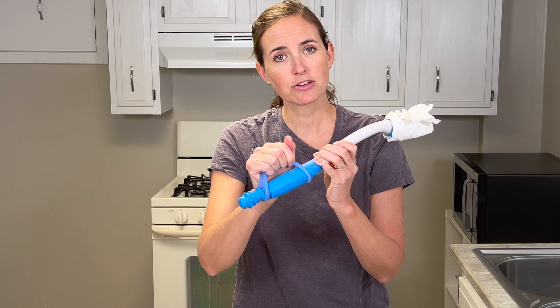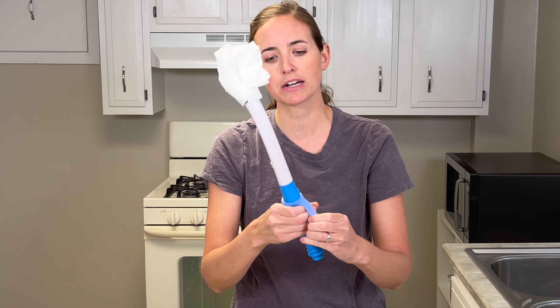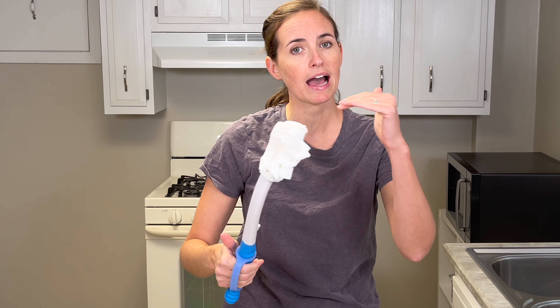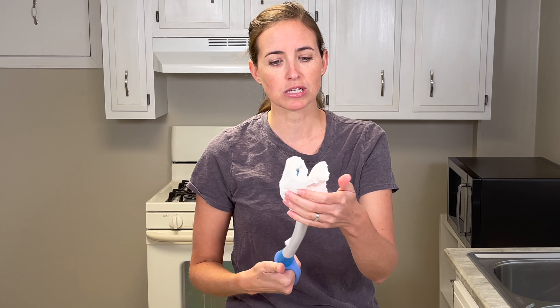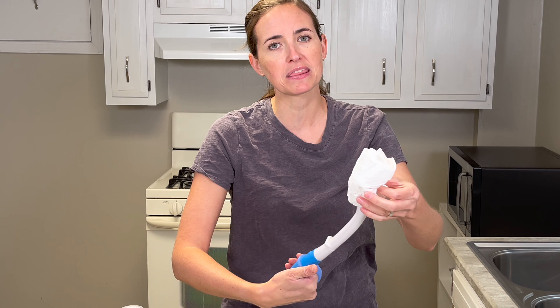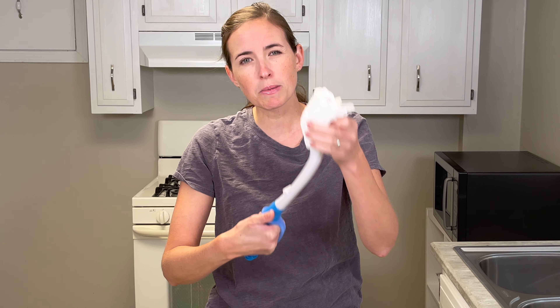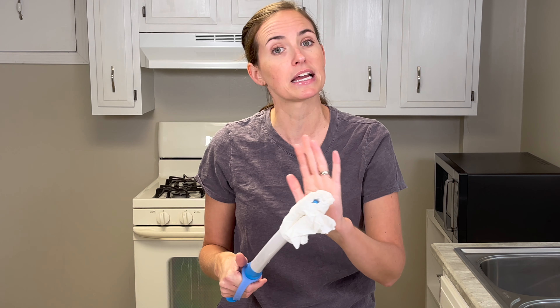I've added an easy grip silicone handle to this one — very hygienic and wipeable — so it works for low dexterity options. This is not as long a tool as the Freedom Wand, so you'll need more dexterity, more shoulder movement, a bit more flexibility, or be a smaller stature to use it. The head is a little wide, which matters if you need to get into crevices for thorough hygiene. However, it is a soft head, so you don't have to worry about causing skin tears.